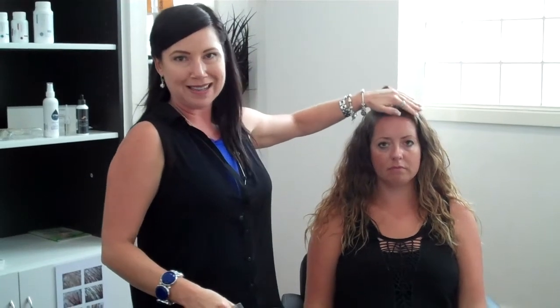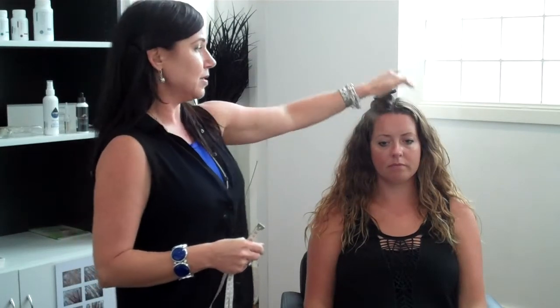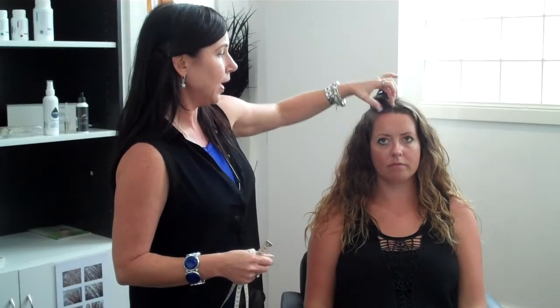When we get to the front area of the scalp, this can be affected by pattern thinning. You've got female pattern thinning and male pattern thinning caused by DHT — dehydrotestosterone — which is very different to the entire hair cycle. So if you're treating DHT, you might need to work on the hair cycle first before working on DHT. You always need to make sure you've got specific locations in the pattern thinning area. With the recessions, find the centre and measure across from it, which we did here.